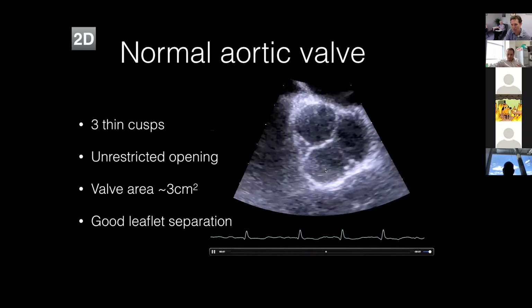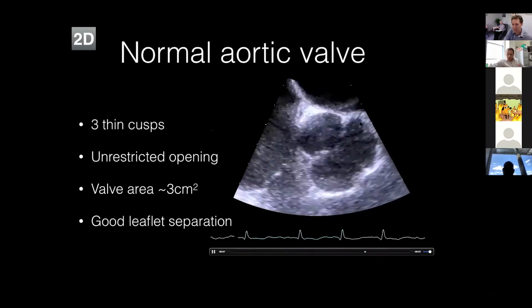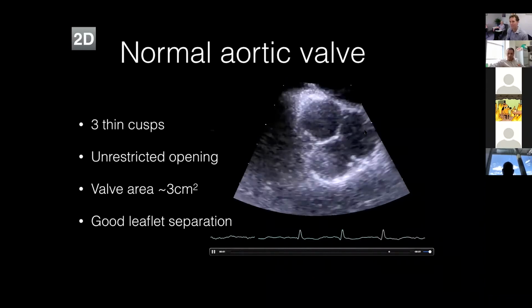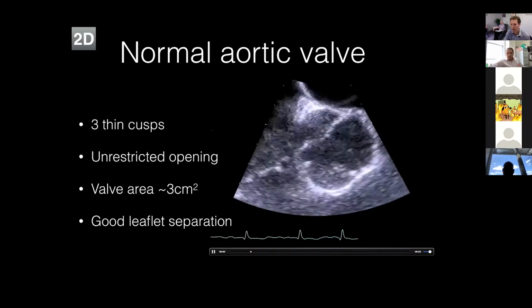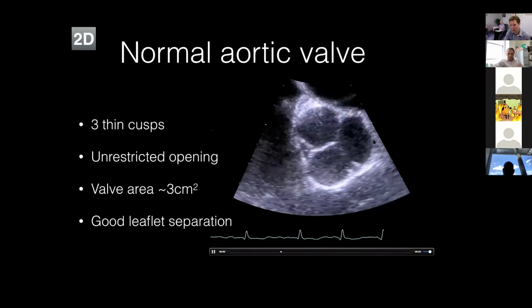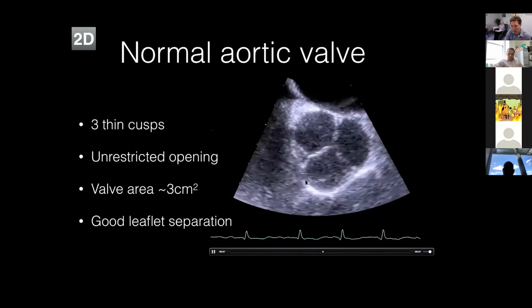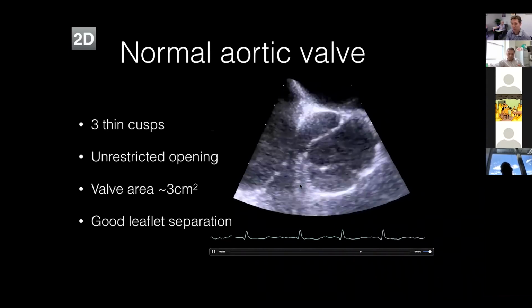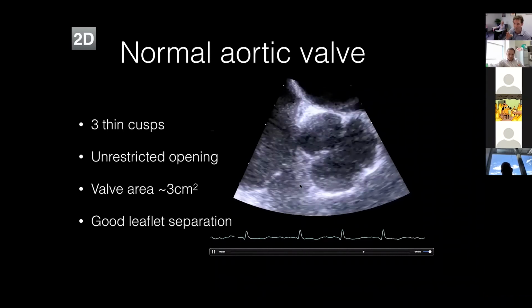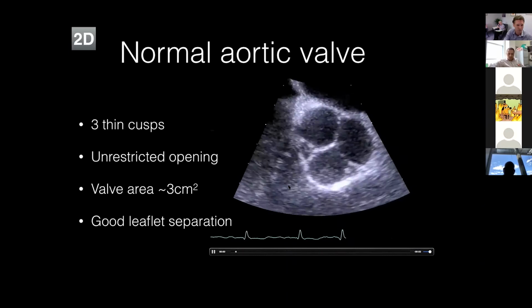Very nice. So that one will be the... That would be the right. Fantastic, because it's next door to the right ventricle, and the one on the left is the left, and that would be the left coronary cusp. Beautiful. And if you go up, you may be able to see the ostium for the left main. Fantastic. You may be able to just see it in there, and then somewhere around about there for the right coronary cusp. So I always start at the intraatrial septum. Next door to that's the non-coronary, and then the right one's next to the right and the left's next to the left.